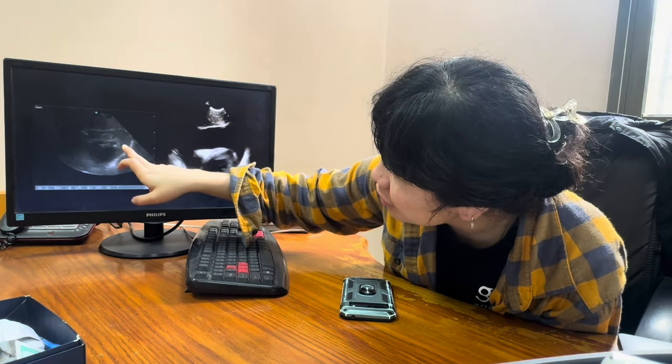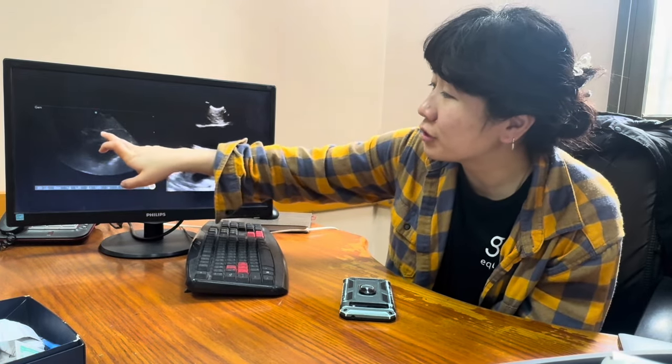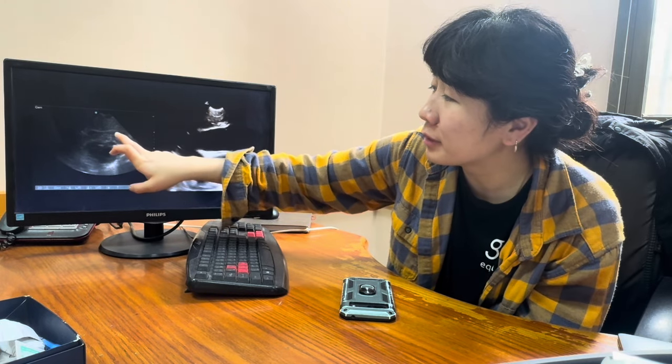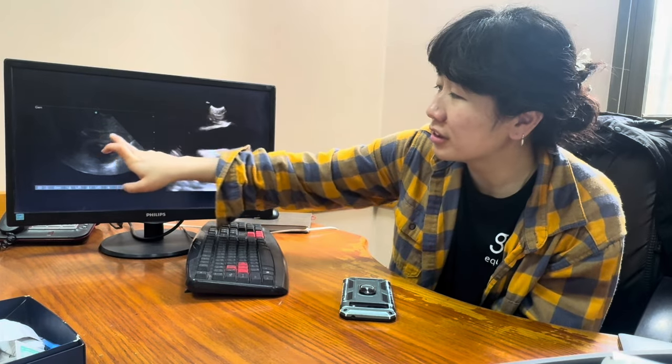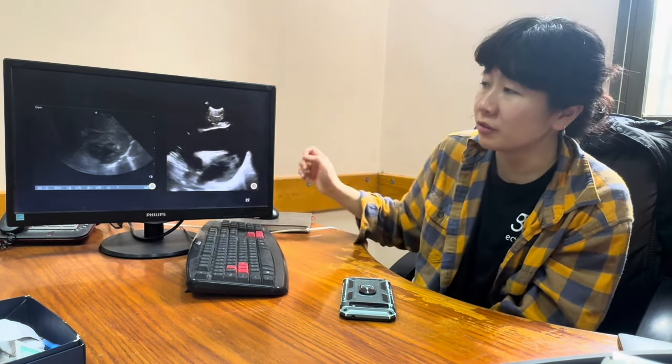And then this one is also positive. There is trace fluid here, and a bit of a clot again. So sometimes it can be very obvious, and sometimes it can be a little bit more subtle.